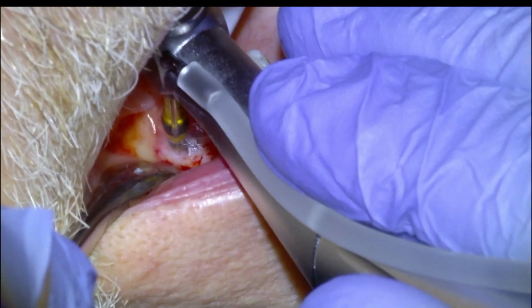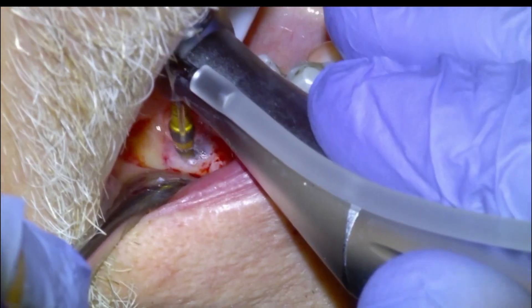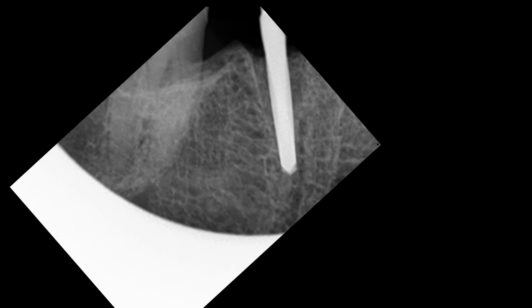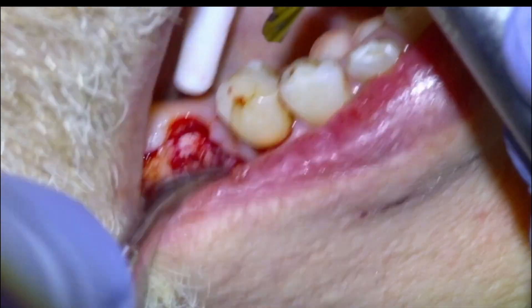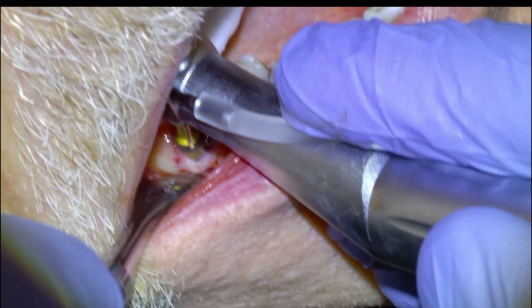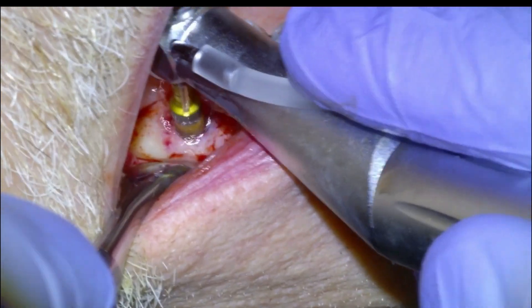We plan to place a 4.8 millimeter diameter by 12 millimeter length tissue-level implant. I get my implants from Blue Sky Bio — they're strong and compatible. We'll keep opening up the osteotomy. We got a pilot PA there with a bit of a cone cut, but enough information to tell us we're on the right track, so we'll keep opening up.